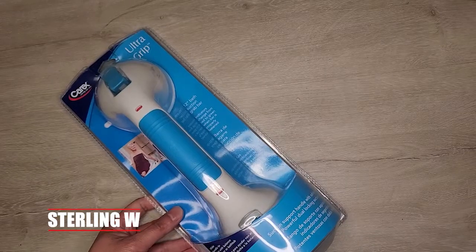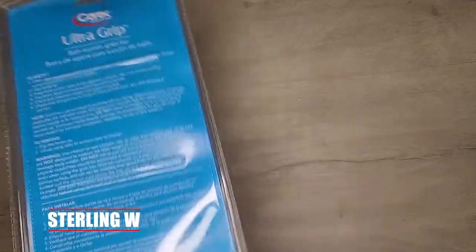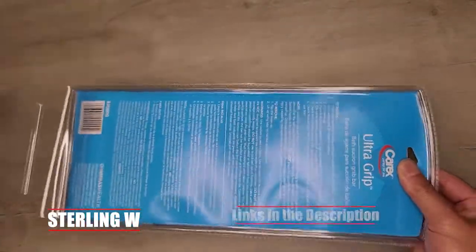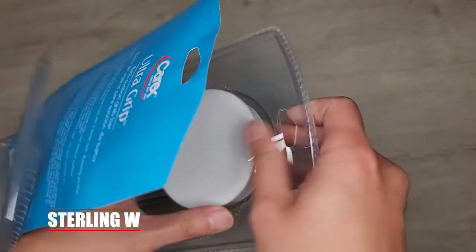That is a pretty strong grip. Hey guys, it's Tony Debbia, and this is the Carex Ultra Grip. It's basically a suction grip that you can add to your shower or tub. My grandma has problems getting in and out of the tub now, so I decided to get this Ultra Grip so she can hold on to it while going into the tub or into the shower.